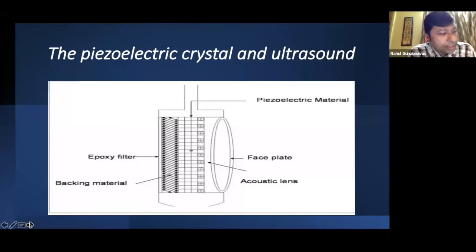Piezoelectric elements in the probe transducer emit ultrasonic waves that are partially reflected back from layers of different tissue densities. These received vibrations are then transformed back into electrical pulses, which are converted by the scanner into a digital image that we see on the screen.